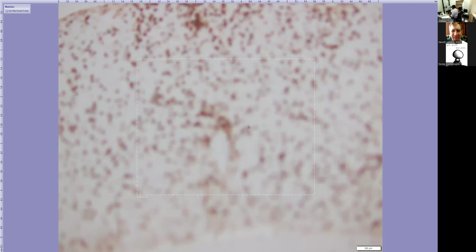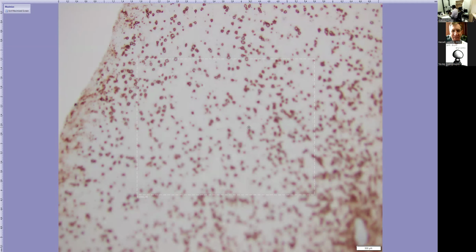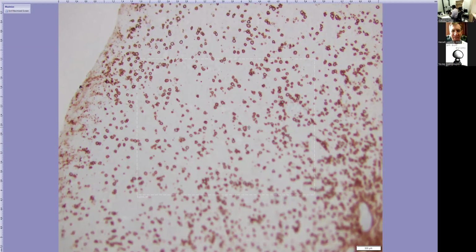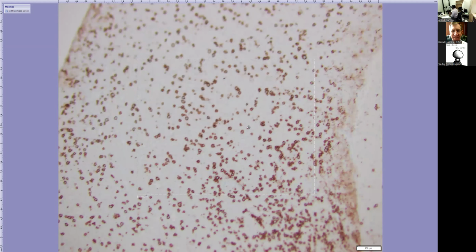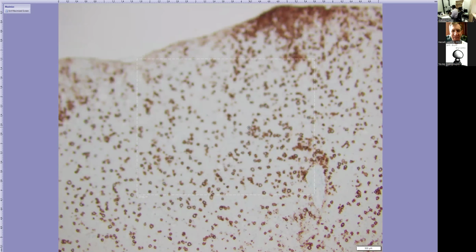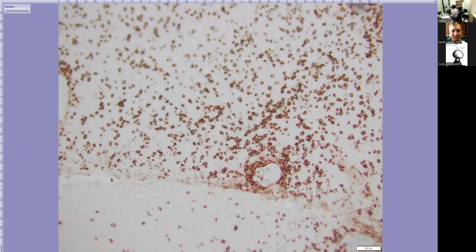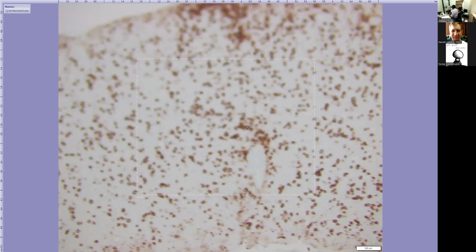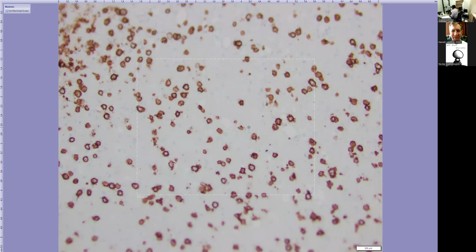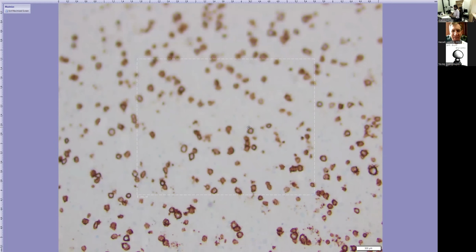This was interesting because usually CNS lymphomas tend to form a mass, which you can see by radiology. This patient did not have such a mass. The patient had a diffuse involvement of the brain parenchyma, and you can see why. Even in this biopsy, you see the CD20 cells going around the entire parenchyma. It is slightly accentuated around the blood vessels, but most of the cells are taking a stroll in the parenchyma. So CD20 was positive in those cells, and these cells are slightly intermediate in size. It was not obviously large cells, but more like intermediate size cells.